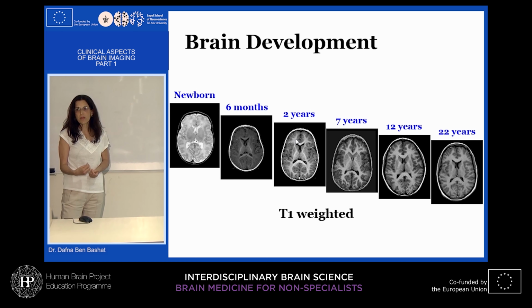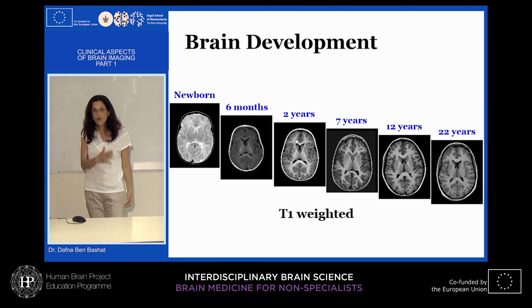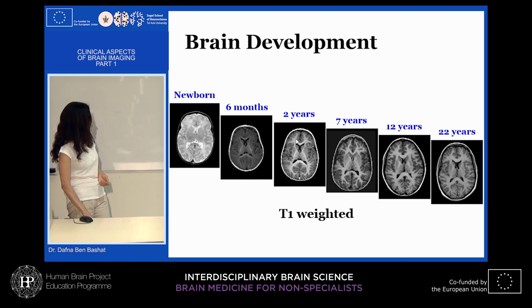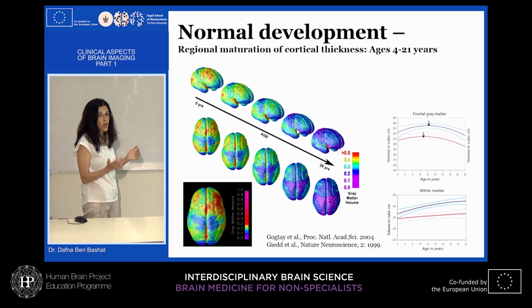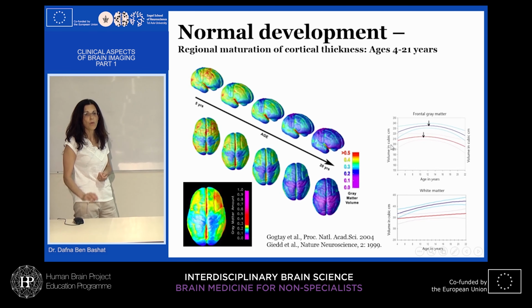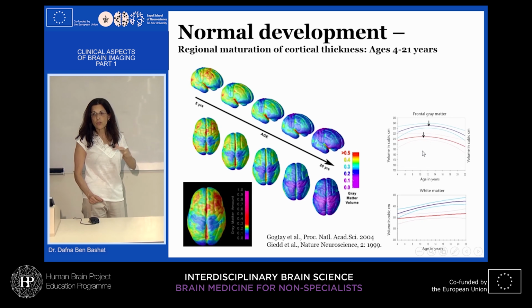In every study in pathology, we really need to understand what is normal. Imaging of development, especially during the first year, is one of the most complicated because the normal dynamic changes are very wide. There is a lot that can be studied, such as segmentation, cortical maturation, and cortical folding, also in preterm infants. We can get information about specific white matter or gray matter structures, and normal maturation graphs for boys and girls.